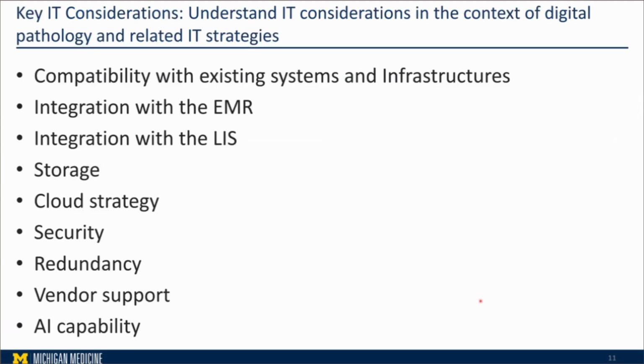One of the IT key considerations you really need to take into account is to understand those considerations and put them into the digital pathology and related strategies. For example, how compatible is the system we are trying to have with the existing systems and infrastructures?